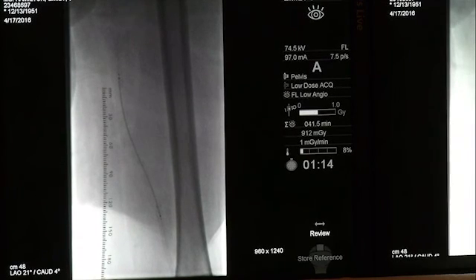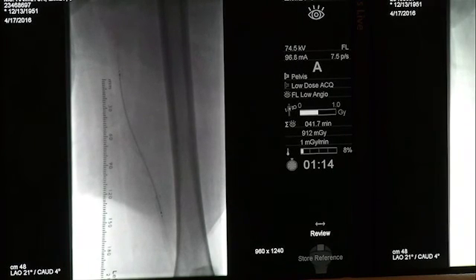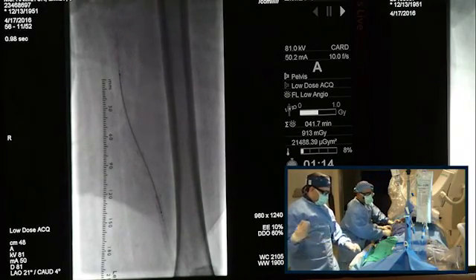So let me ask you, how much overlap do you usually do with the Viabond? I'm interested in the panel take on this. Few millimeters. This is very accurate with the marker, so I don't go that far unless you have oversized the length. Several millimeters. Dr. Manzi, lot of overlap, little overlap? Just half centimeters, no more than one. No more than 1 centimeter.